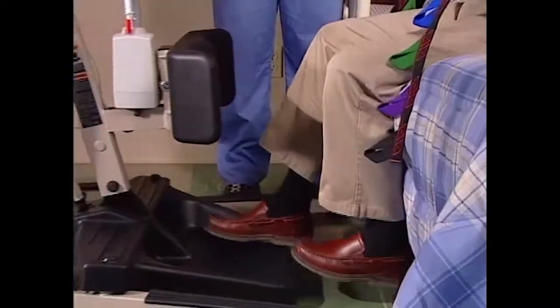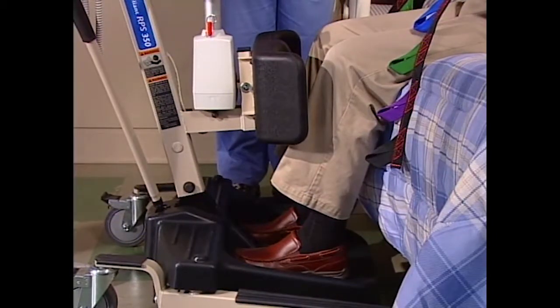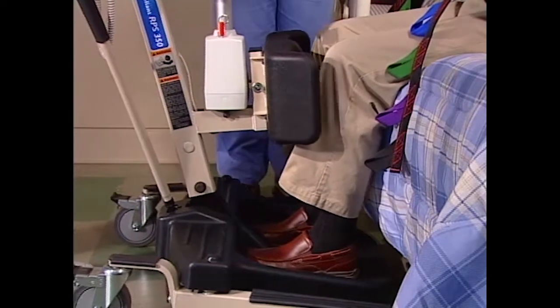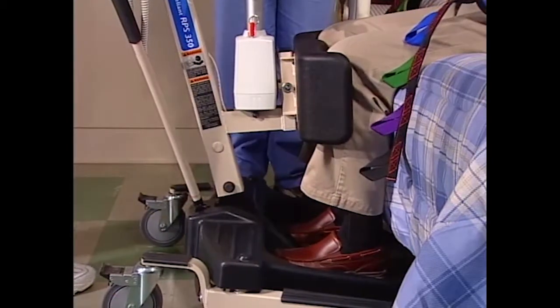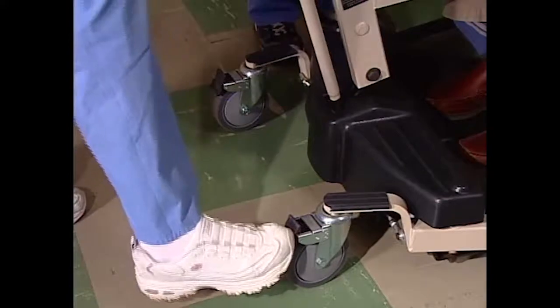If they are incapable of doing that, lift their feet for them. Roll the lift into position and stop once their knees are securely against the knee pad. Lock the rear casters to secure the lift for attaching the sling.